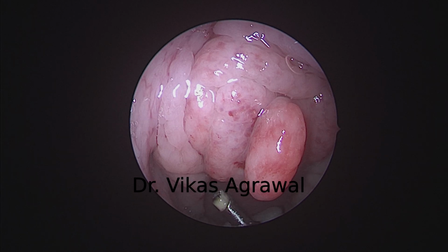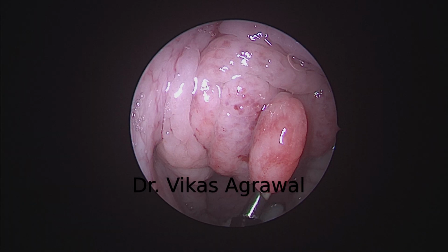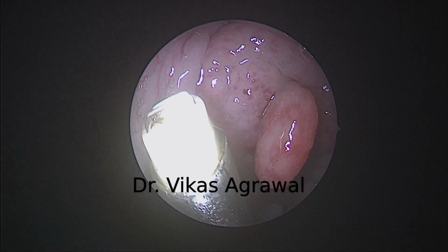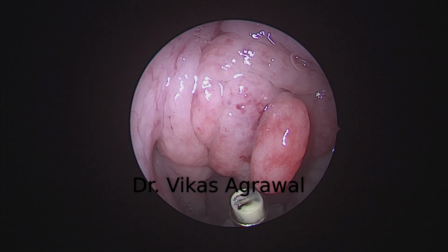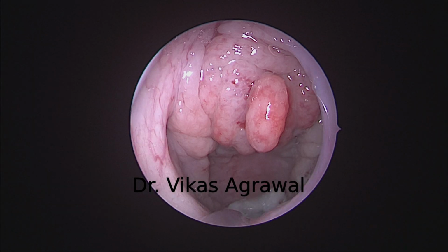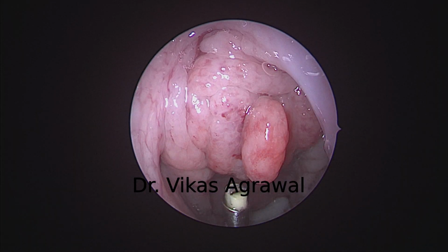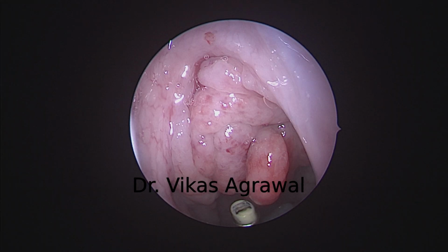So here you are watching coblation adenoidectomy in a 6-year-old child with obstructive symptoms and some ear-related recurrent issues. You can see the adenoids are almost grade 3. You can see the palate is being pulled with the soft rubber catheter. This video is being recorded on 20th March 2025.